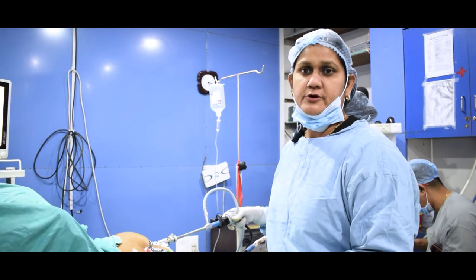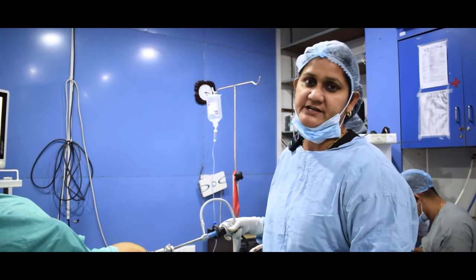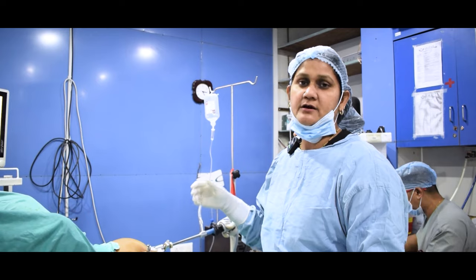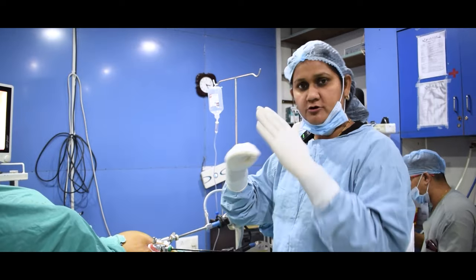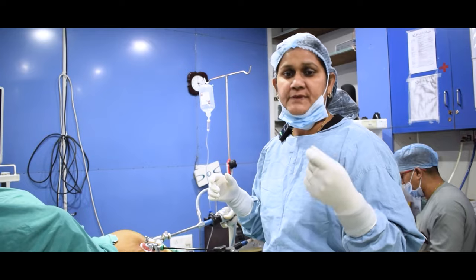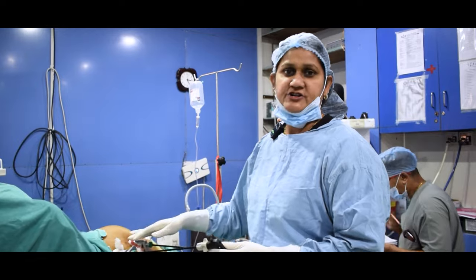The uterus and tubes are removed together. The uterus is removed using a laser instrument, and the procedure is performed laparoscopically. As you can see, the operation is performed through three to four small incisions.